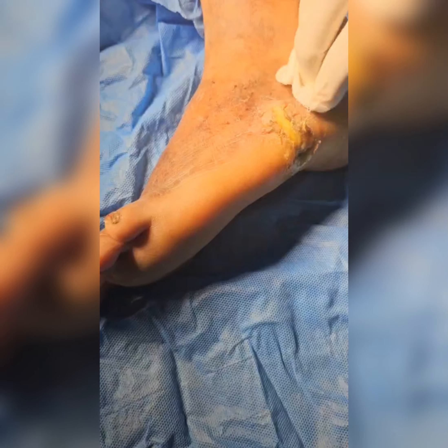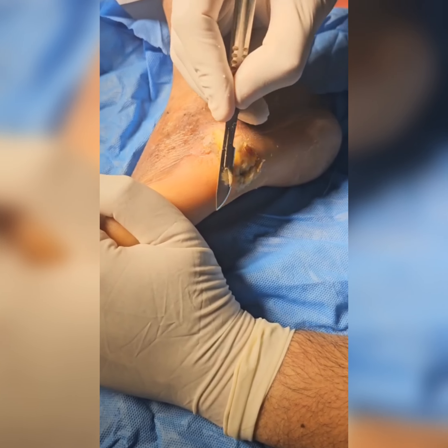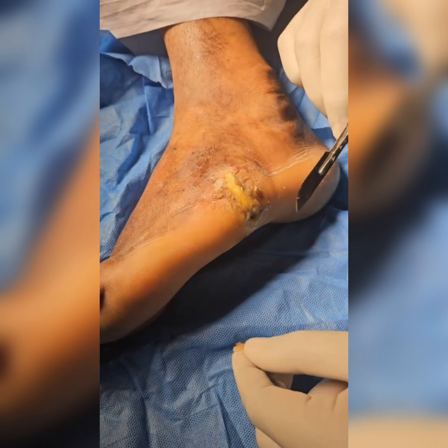Trophic ulcer forms a major chunk of diabetic foot, and callosities are a greater hindrance to its healing. Here in this video, I demonstrate how to remove these callosities.